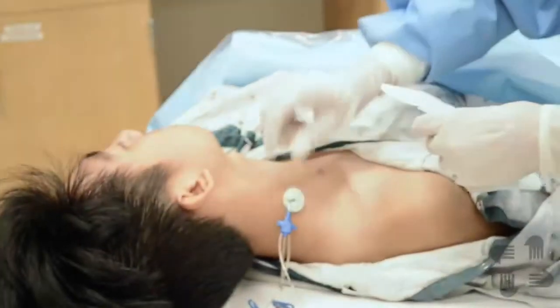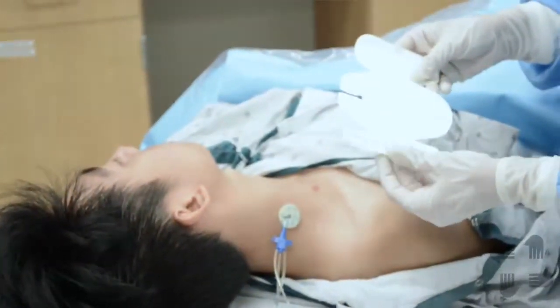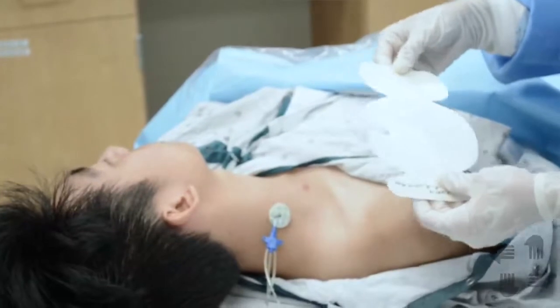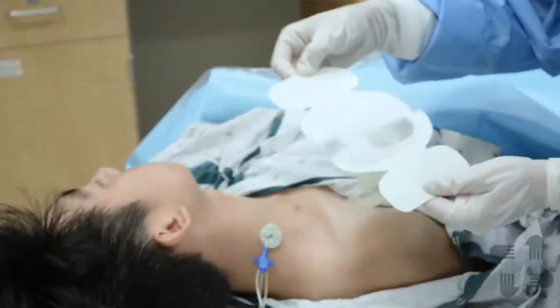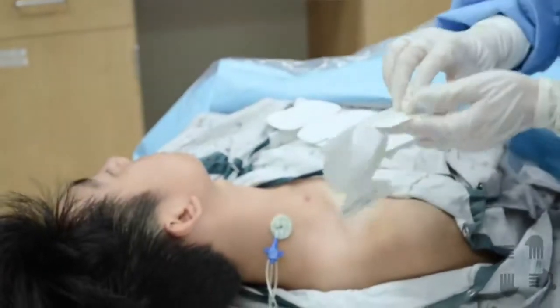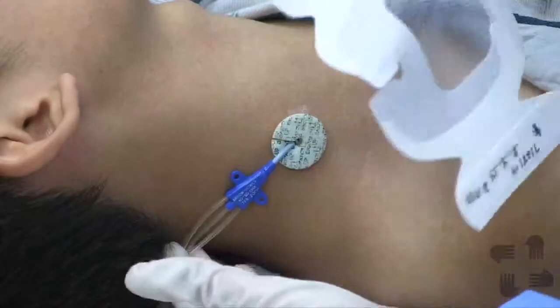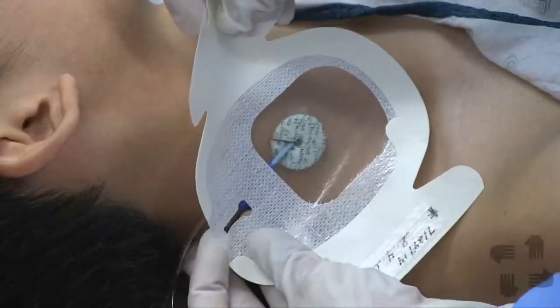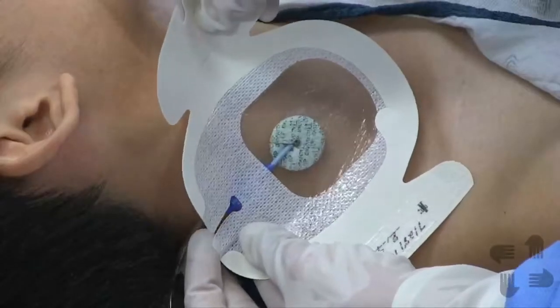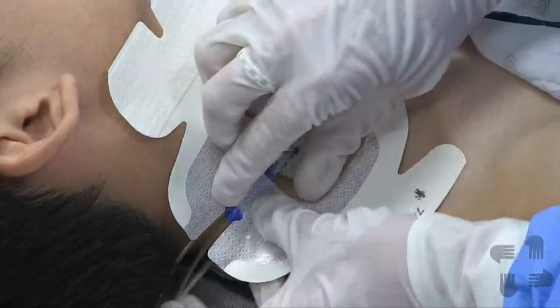Then you take your dated transparent dressing. The dressings need to be changed every week unless the integrity has not been met, and then it's changed more frequently. So the first section gets peeled off the back, and then the dressing is centered so that the line will fit through this insert. You're going to want a slight amount of blue coming through the hole.